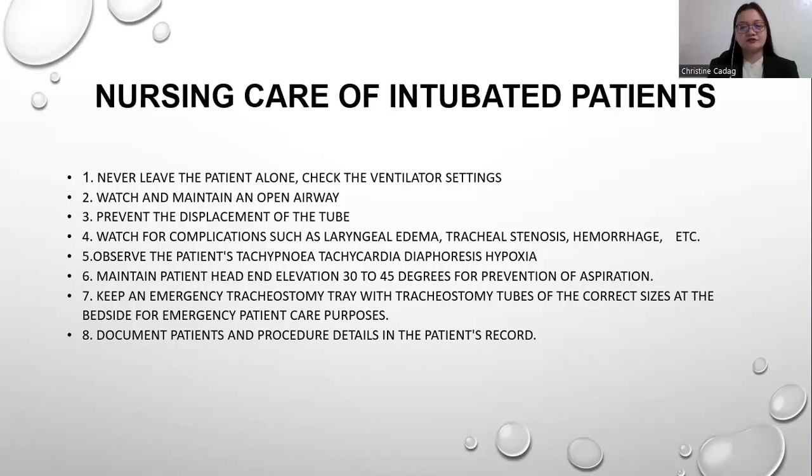It is also important for the nurses to watch the patient closely and record the changes, if the patient is tolerating the settings or not, if the patient's condition improved or not. So you need to check it properly.